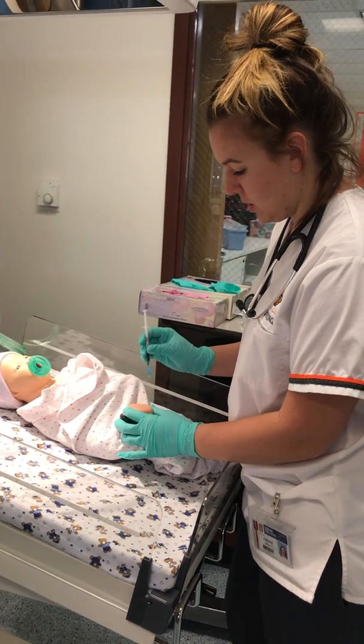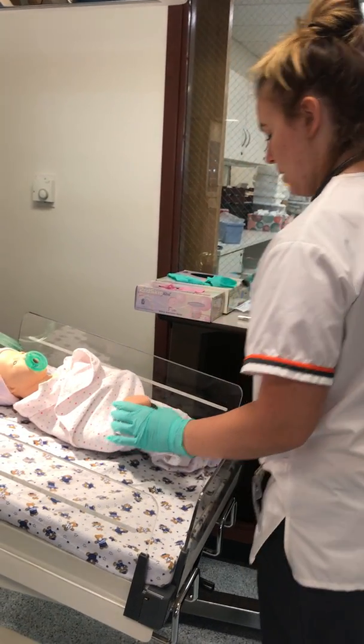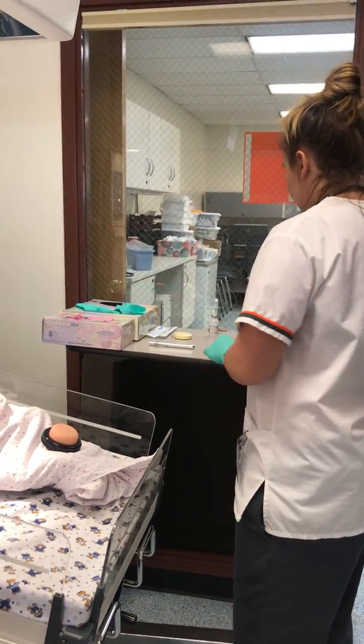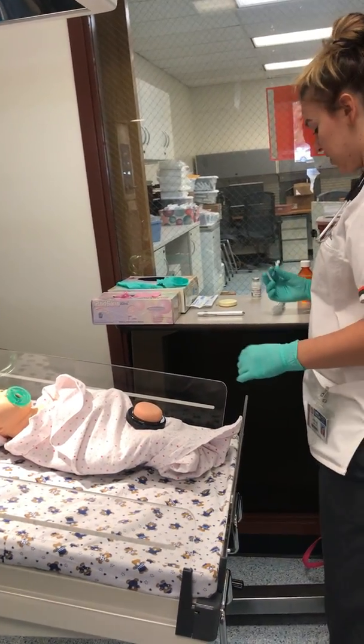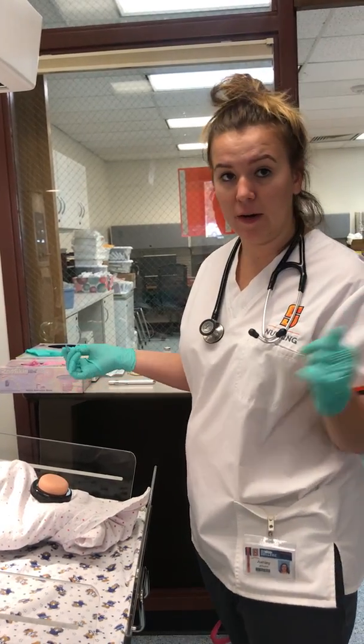So I'm going to just inject, never recapping, putting that in there. And I would either have another nurse with me so that we could do this at the same time, or I would suggest to the doctor, since this baby has an IV, just bolusing it in.